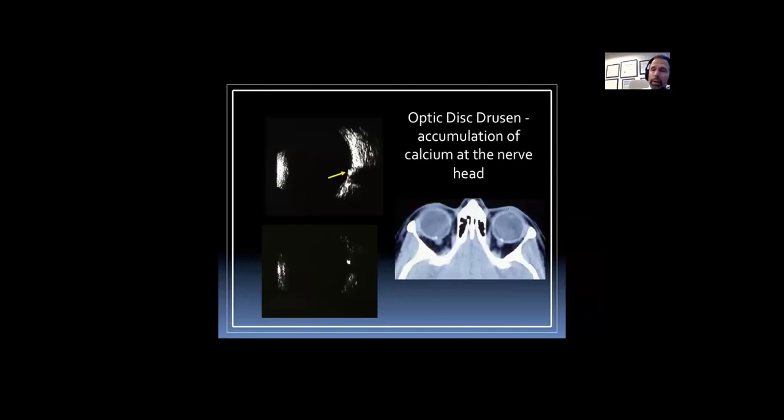These can be diagnosed even if you can't see them. Now, I'm not going to get B-scan ultrasonography in the patient we just saw because those drusen are obvious, but sometimes you'll see so-called buried optic disc drusen. You can identify those with B-scan ultrasonography. Here's the optic nerve shadow. Here's something suspicious that looks like it may be drusen, and indeed when you change the gain and get rid of the soft tissue signal, you see this prominent calcification at the optic nerve head.